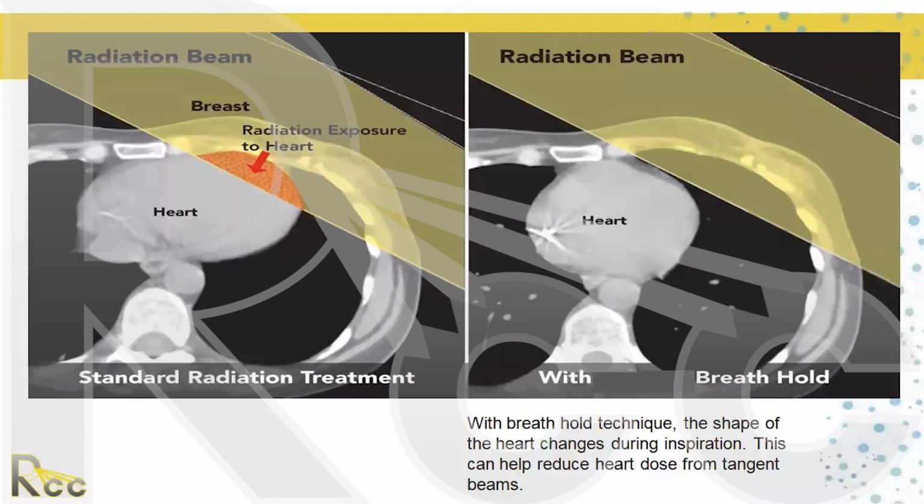But what if that's all you have in your clinic? What if a Cobalt is the only machine that you have in your clinic? And then you're saying, what do I treat with it? Well, you can pretty much treat everything with it. There's no limit because, as I said before, dose is dose. You can give the same dose with Cobalt. You can give 70 gray to a tumor with Cobalt. You can give 70 gray to a tumor with a linear accelerator and IMRT. But look at the dose to the surrounding normal healthy tissue. That's where your limitation is going to be.